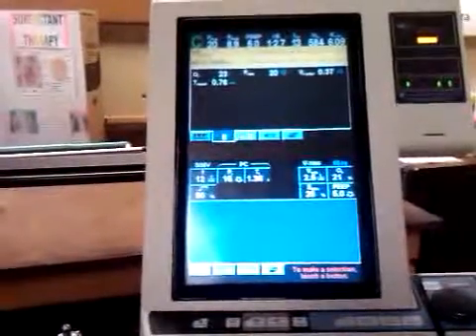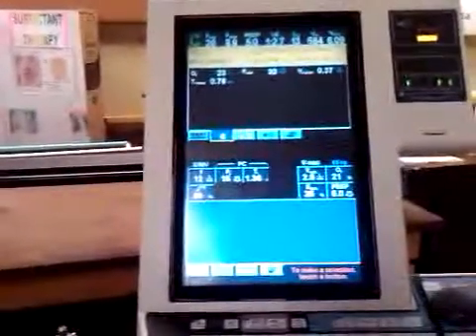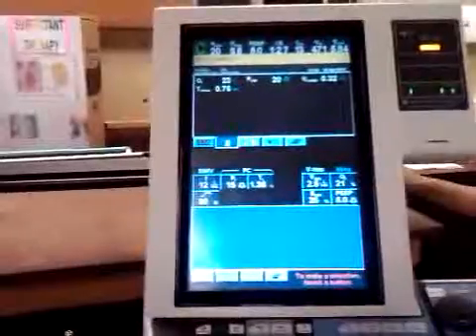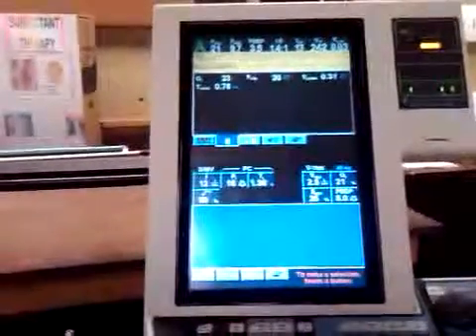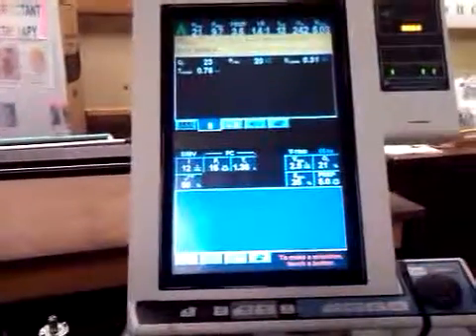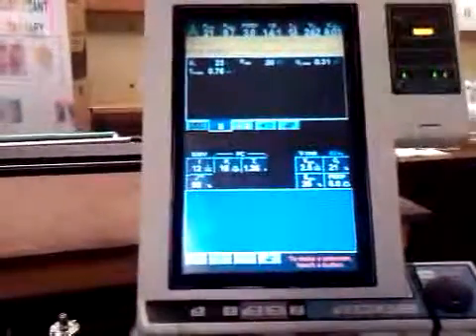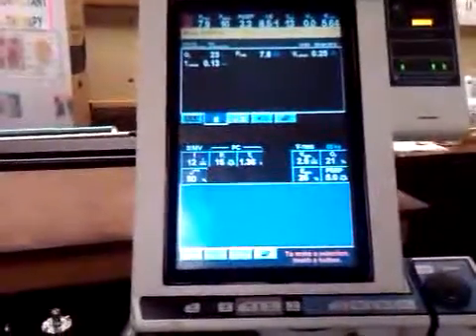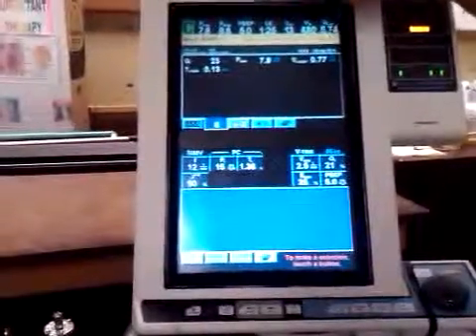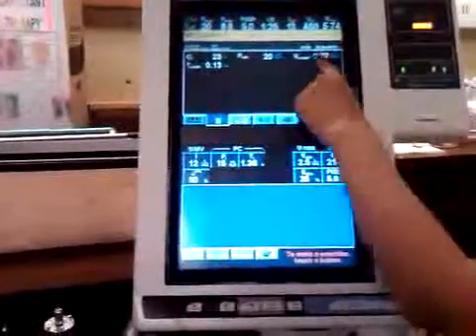Why is it taking forever? Always look at this. Spontaneous frequency, total minute volume, and your spontaneous minute volume.